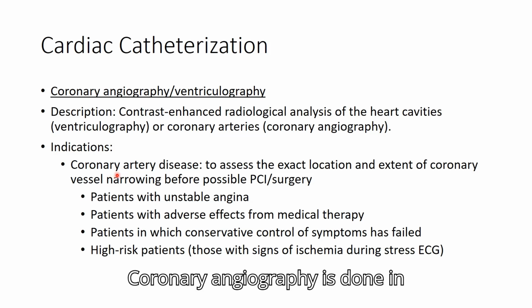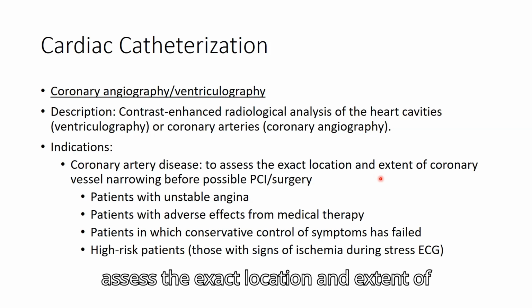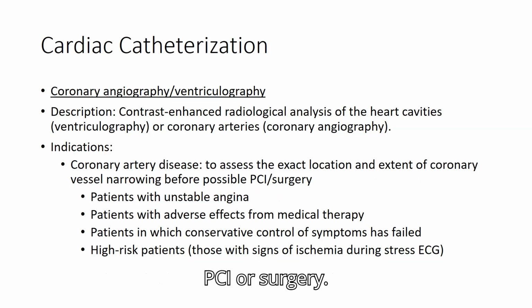Coronary angiography is done in coronary artery disease patients to assess the exact location and extent of coronary vessel narrowing before possible PCI or surgery.